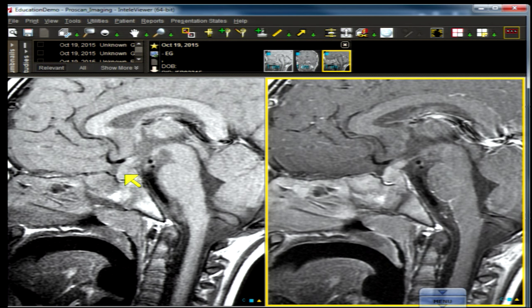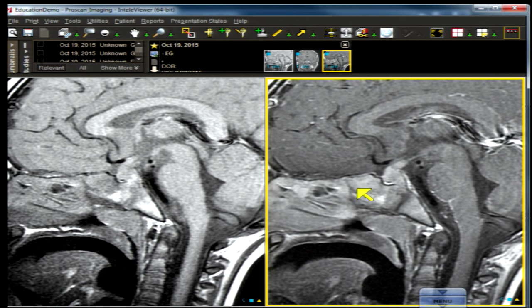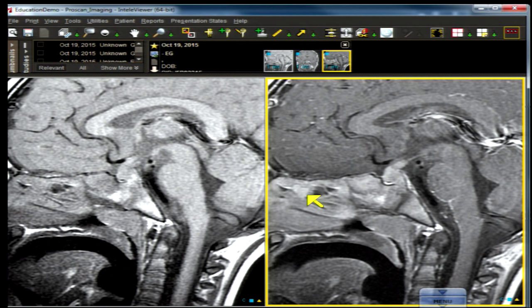Let's go back and look at our three-year-old. The sagittal projection shows involvement of the pituitary gland by a mass with stalk involvement that enhances — in fact both enhance. There is no subarachnoid space enhancement, but there is enhancing tissue in the sinonasal cavity, which can be a manifestation of this disease.